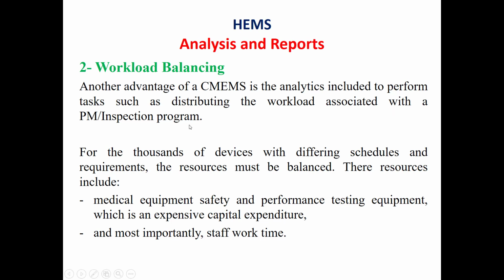As we said before, it's very difficult to make a preventive maintenance schedule for a hospital or medical center with a large number of medical devices, and even more difficult is assigning the tasks generated by this PM schedule to the staff available in the Clinical Engineering Department.